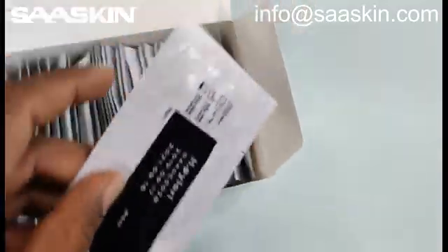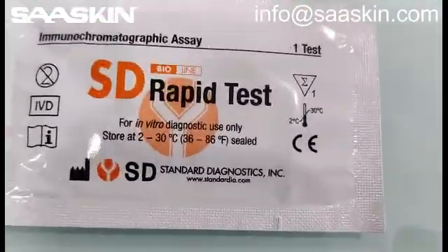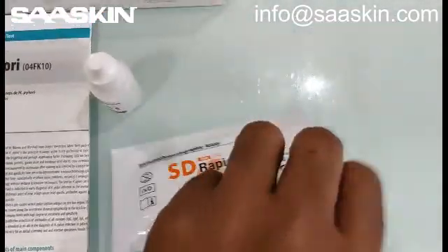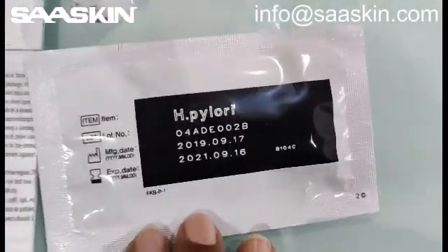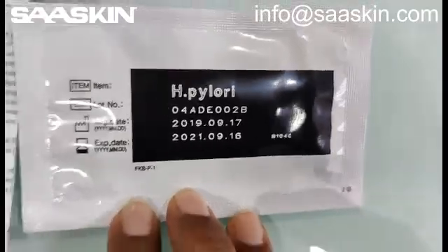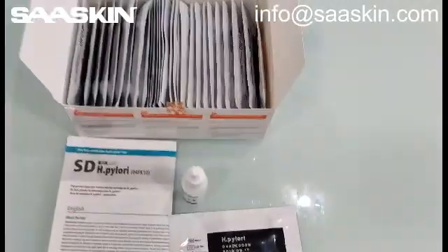Let me show you how the single test cassette will look like. Here is the single test cassette. And let me show you the other side of the test cassette, which shows the manufacturing and expiry, which is typically two years.